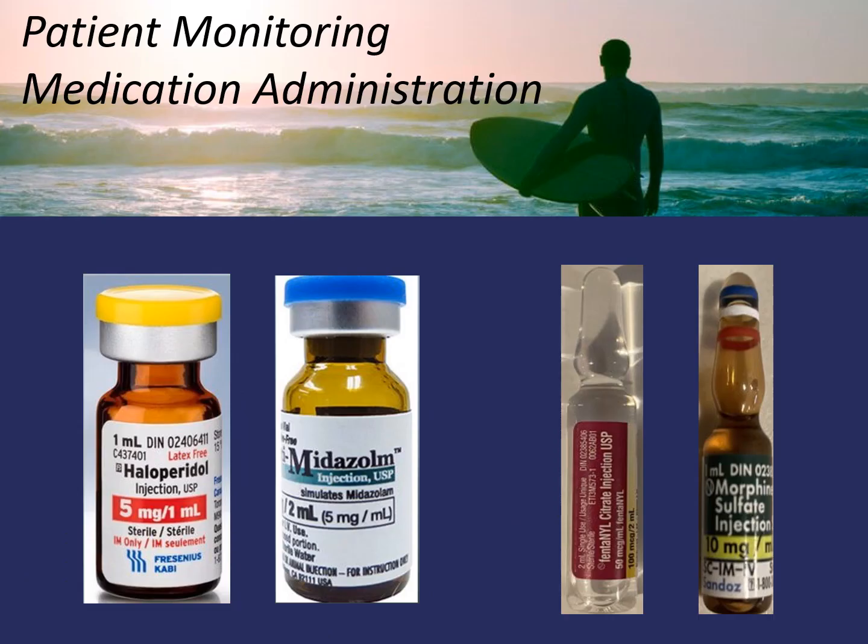So continuing on with respiratory depression, anytime we sedate our patients, we run the risk of causing respiratory depression. Capnography can rapidly detect the common adverse airway and respiratory events associated with sedation, including respiratory depression, the patient becoming apneic, upper airway obstructions, laryngospasm, or bronchospasm.